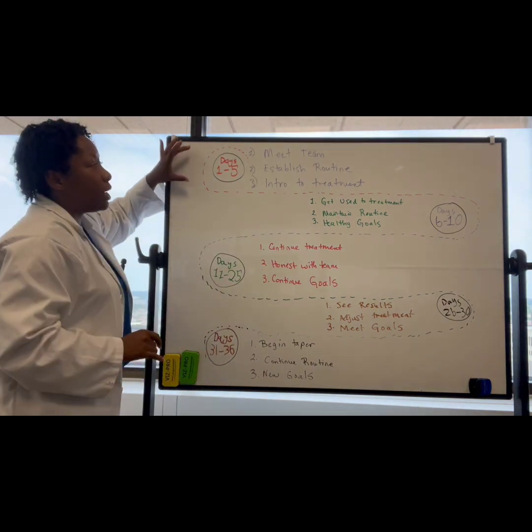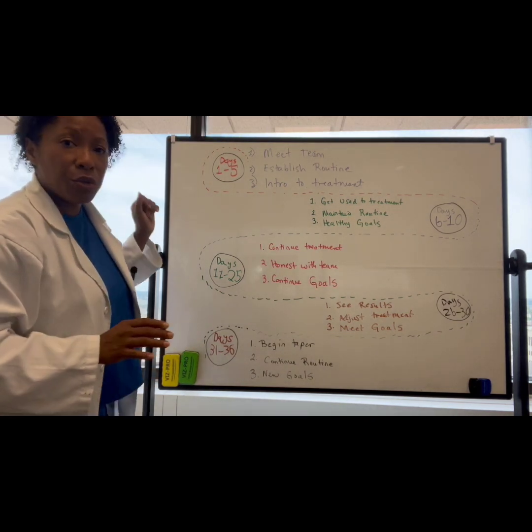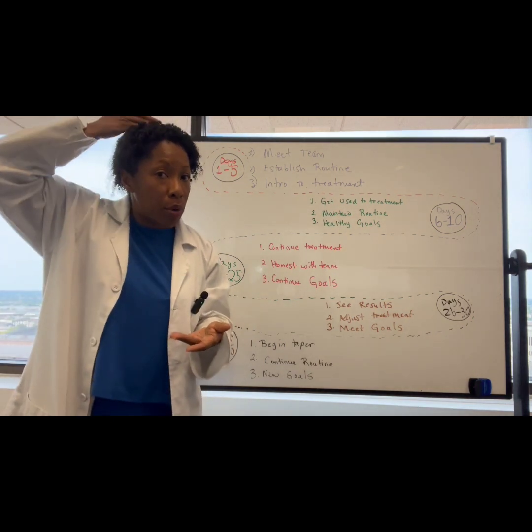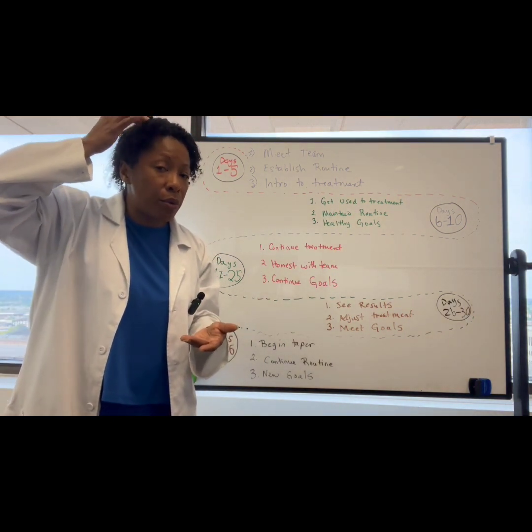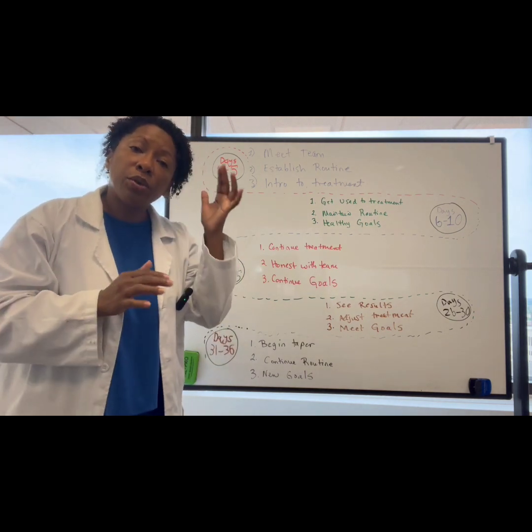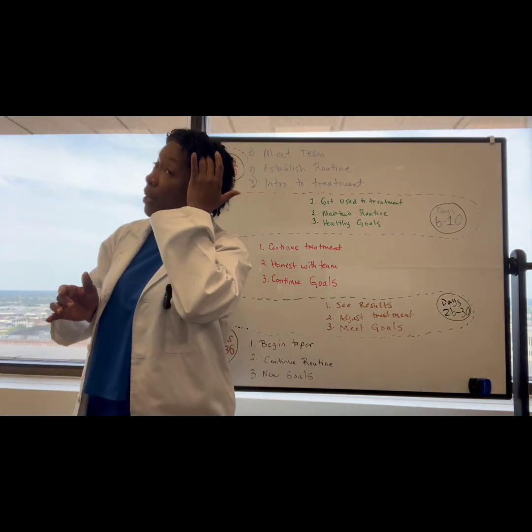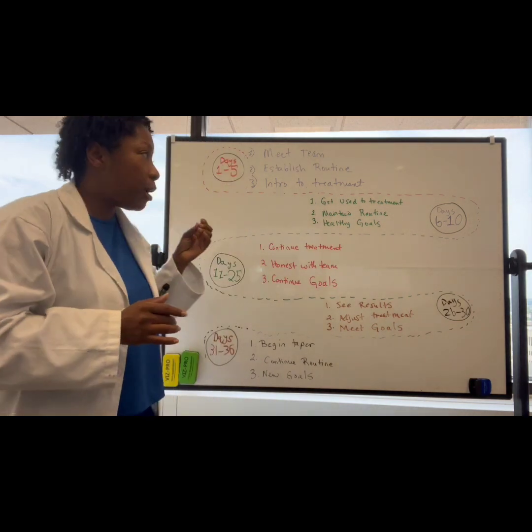First of all, in days 1 through 5 of your actual treatment, you are going to meet your treatment team that very first day, and they're going to do something called mapping, where they're looking at your motor cortex and then extrapolating, either using a 5 centimeter rule or something called the F3 beam method, to find the area, for most people the dorsolateral prefrontal cortex, that they're going to mark and be utilizing. That's right here, around that area up here.